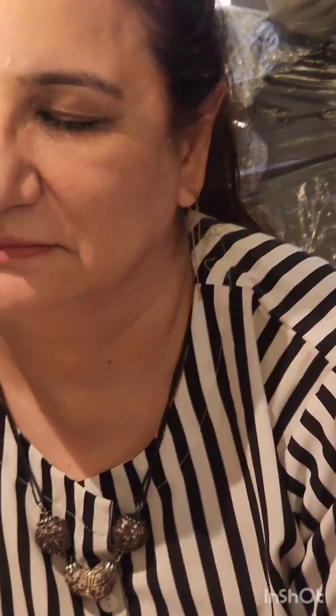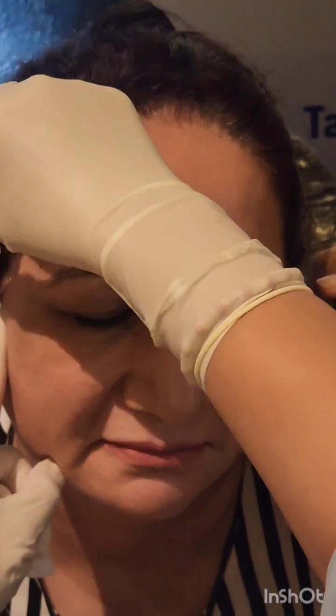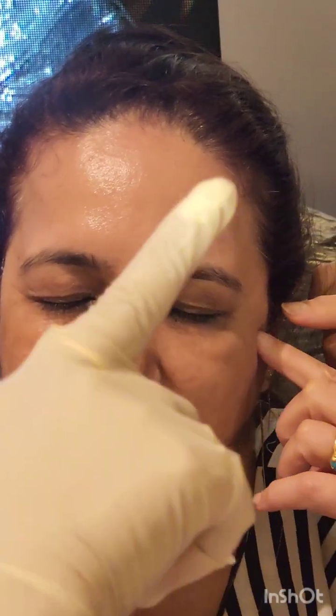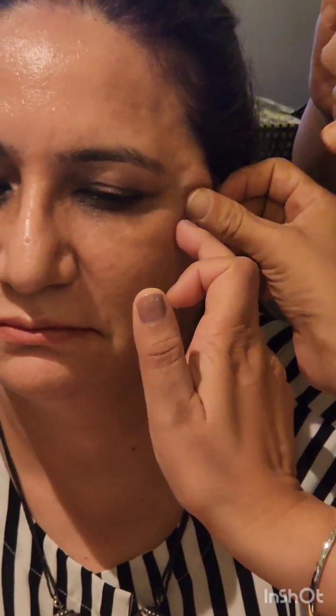Right? So the entry point will be the same on both sides. Yes, that will give you symmetry of the face. Got my point? So this is our entry point, ahead of the hairline, so that hair does not enter through the entry point and lead to granuloma formation, infection, or any tract along the thread. I can also go from behind the hairline. If I have a scissor, I'll cut the hair from that area so that when I'm entering, there isn't any hair. Alright? So now can I mark it?